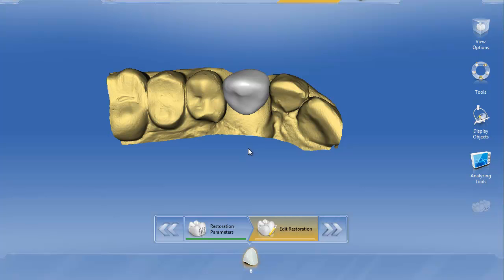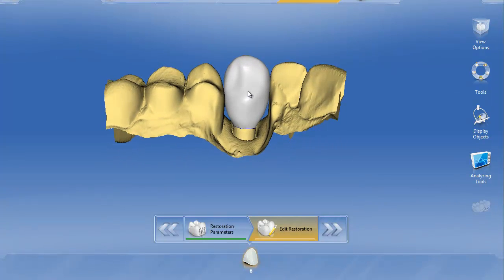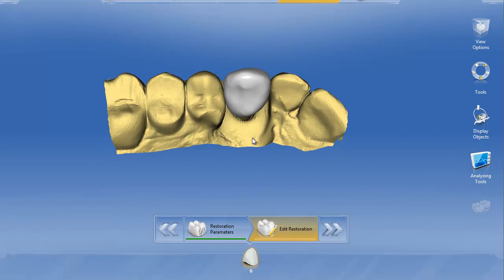With InLab there's a way you can actually do this to get a nice start to that screw access hole. Here we've got tooth number 6, designed for a temporary screw retained restoration on a Glidewell 6mm tie base.